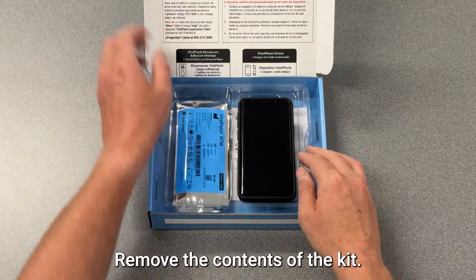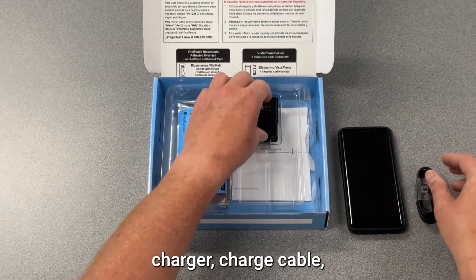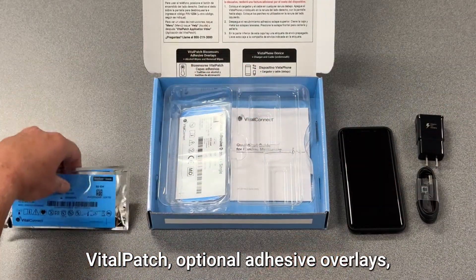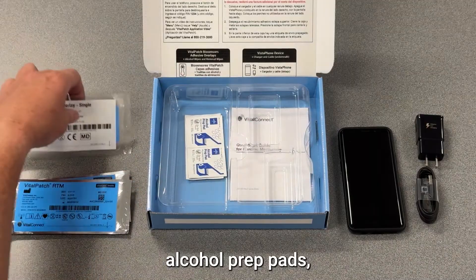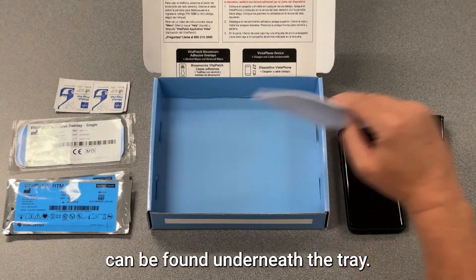Remove the contents of the kit. This includes the Vistaphone, charger, charge cable, Vital Patch, optional adhesive overlays, alcohol prep pads, and adhesive removal pads. The printed quick start guide can be found underneath the tray.